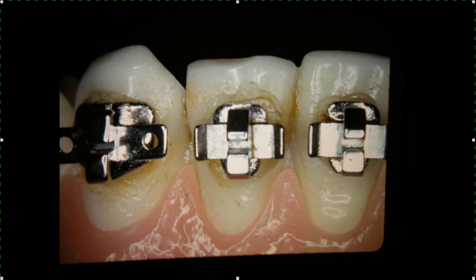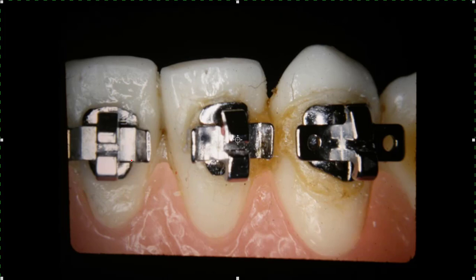On the lower anteriors, these brackets work fine. You see it puts the cuspid up higher - that's a little excess. I like them just about right, and you can learn how to put them on easily enough. You can stick something under the wings and turn them out. Let me get a picture that will show us just looking straight down on the brackets.